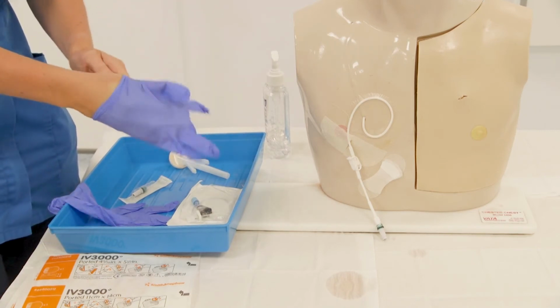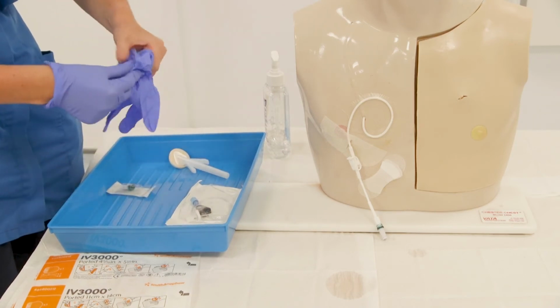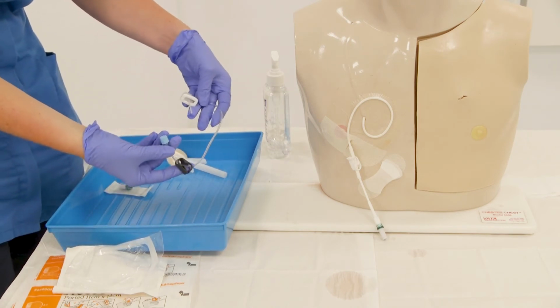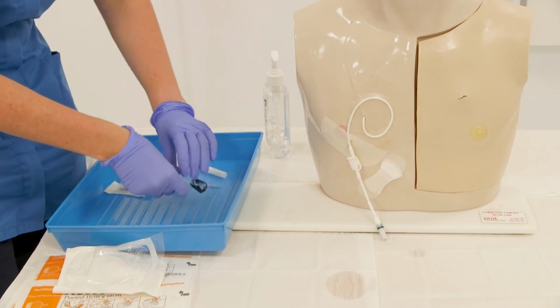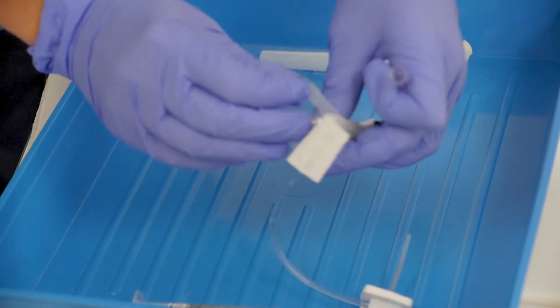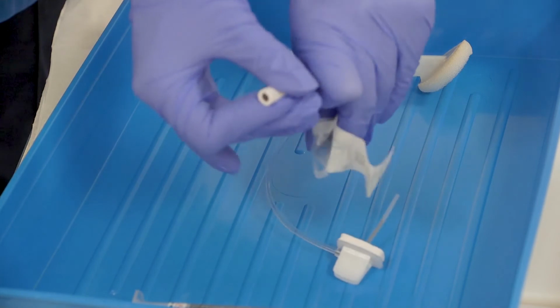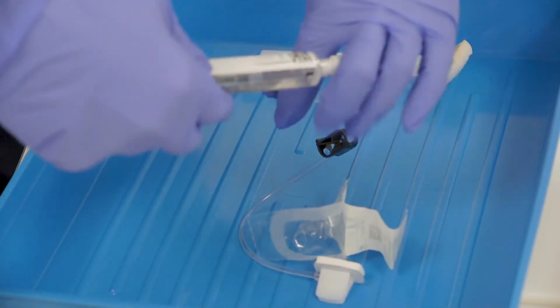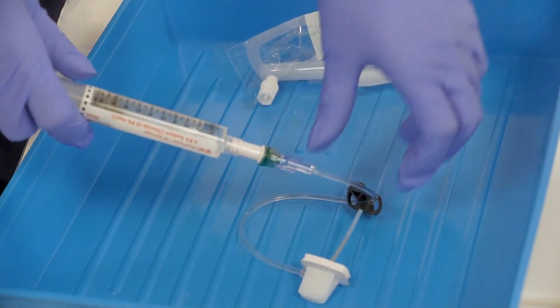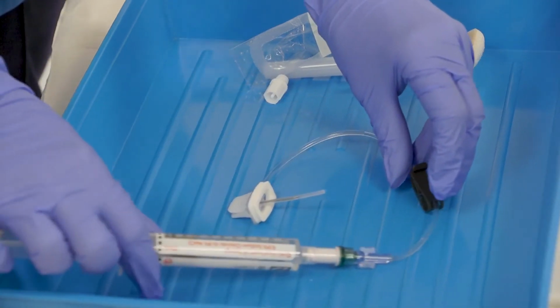Again, because we're not going to be touching any of those key parts, we don't need to use a sterile field or sterile gloves. With our port needles, there isn't a bung or bionector on the end, so we need to make sure we connect that to ensure that we have a closed circuit. Your needle also needs to be pre-primed with saline, so there's not any air in the line, and then you can go to your patient.